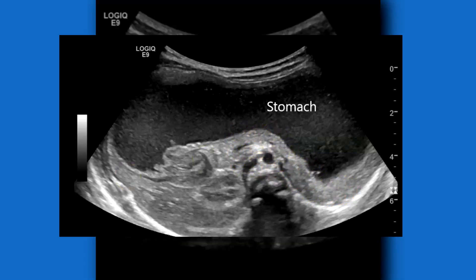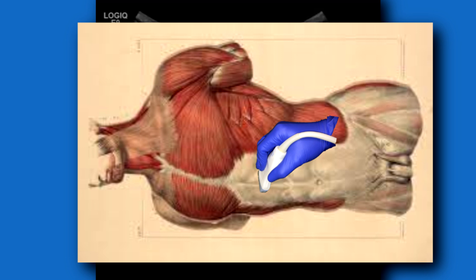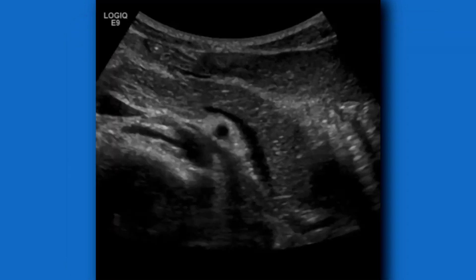This is reproducible — I've done this on adults, anybody who has a stomach. You could also try putting the patient in right lateral or left lateral decubitus to make the air go away from the pancreas. Right lateral decubitus sometimes helps because air rises — if there's air in the stomach it's going to rise towards the left, and you'll be able to see the pancreas in the epigastric region.